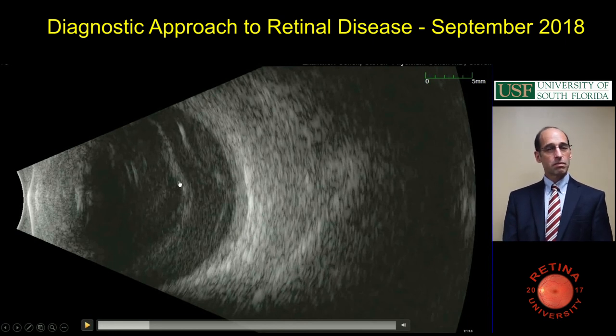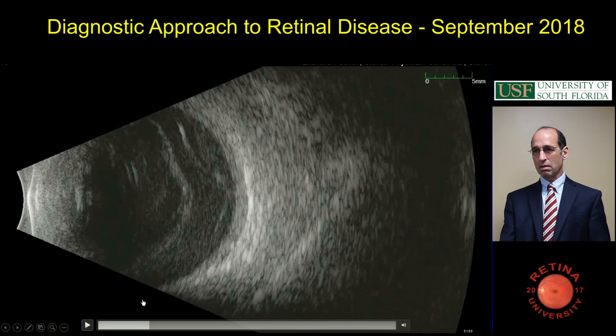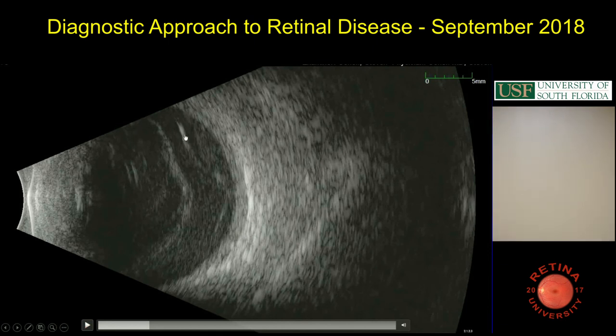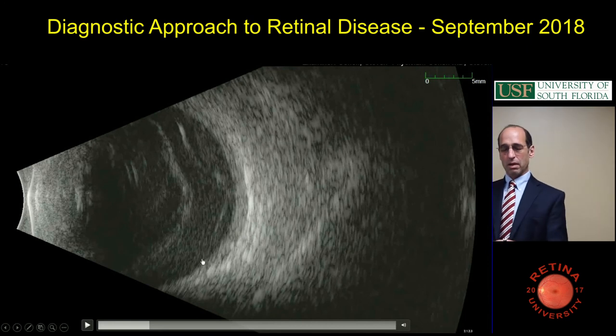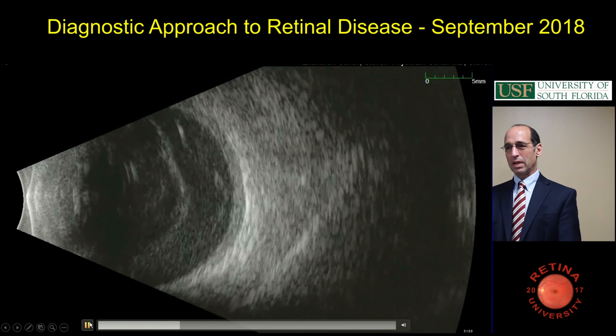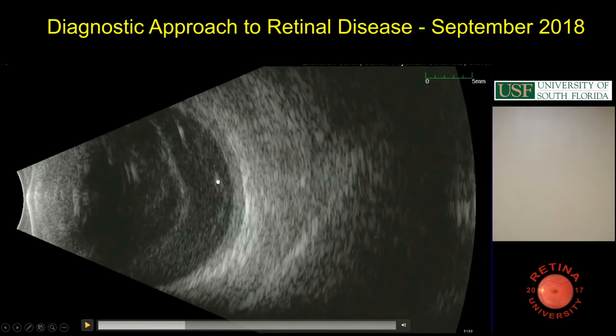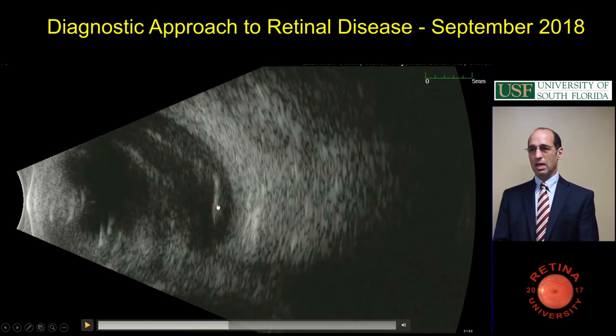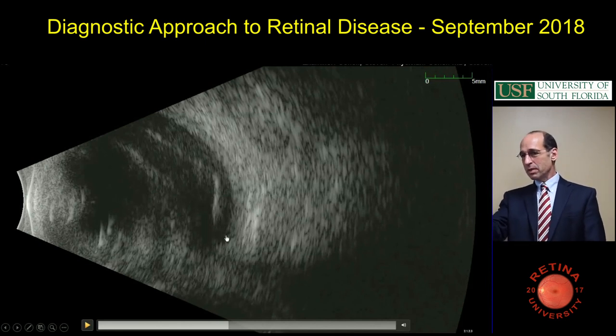Sorry, I didn't see the discontinuity. Would you mind pointing to it? Okay, let me go dark here. So here you get the bright, bright, bright, bright, but not bright anymore. Any place you get bright and then it's not bright. Here, you see bright all the way across, but then it stops there and stops kind of there. And it's not like there's calcium shadowing. The back one is bright, but you see it stops on both sides there.